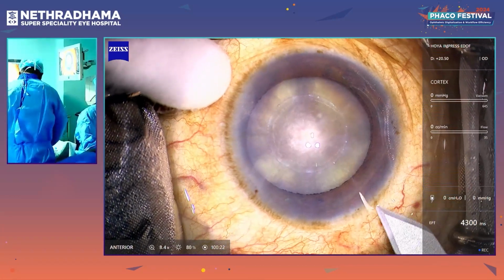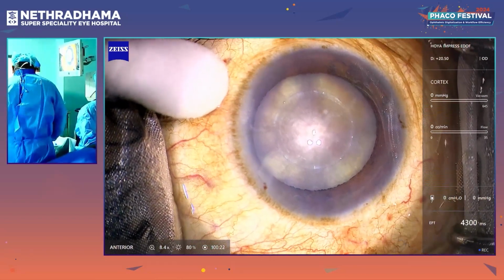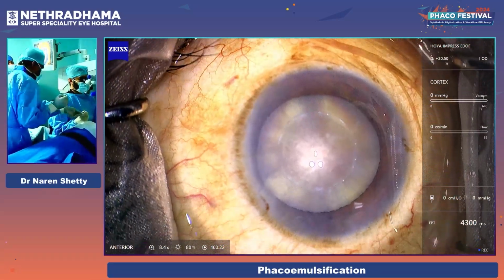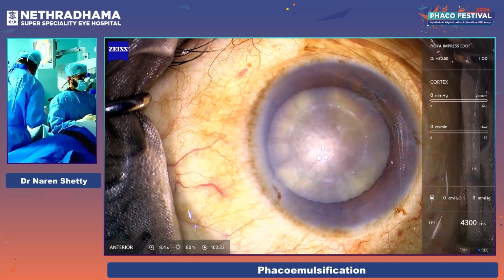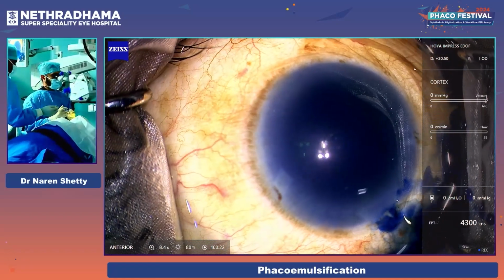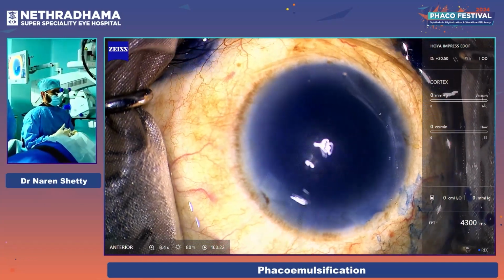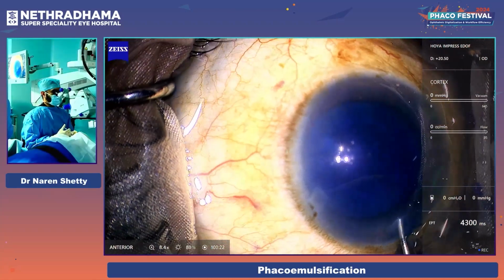So if you look at my main ports, usually I do extremely limbal and a very short one, so as to induce as little astigmatism as possible. Trypan blue, epinephrine also, adrenaline. So even though the femto is done, it's always good to stain once because you have to make sure that it is completed at all points.